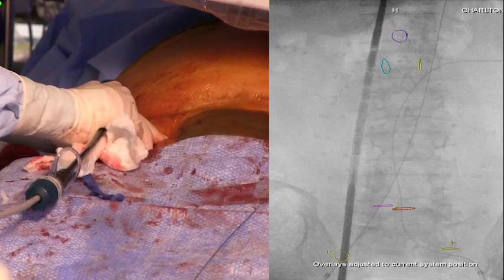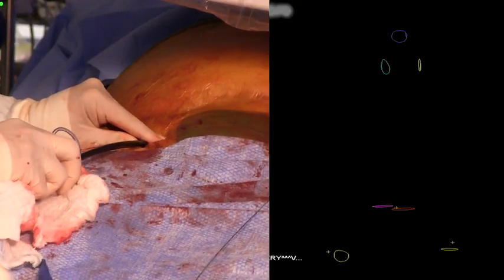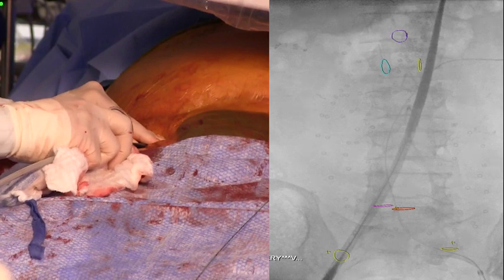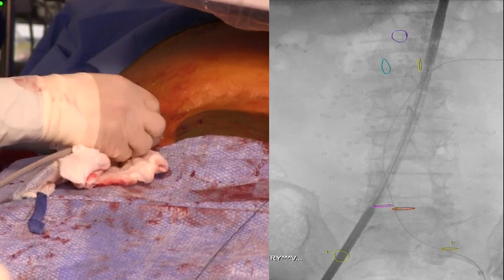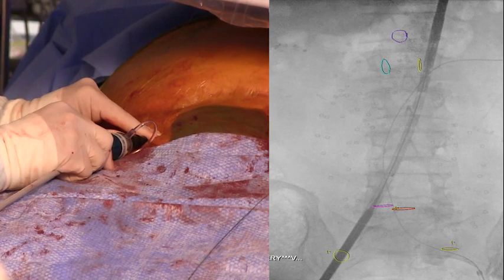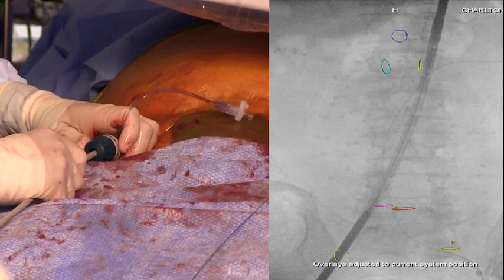Under fluoroscopy guidance, insert the endograft and rotate the graft while advancing to make sure it stays properly oriented. Begin slow, stepwise deployment of the proximal graft, starting about 1 cm above the target position. Pull down on the graft while deploying in order to position the top of the graft 0 to 2 mm below the caudal edge of the lowest renal artery.